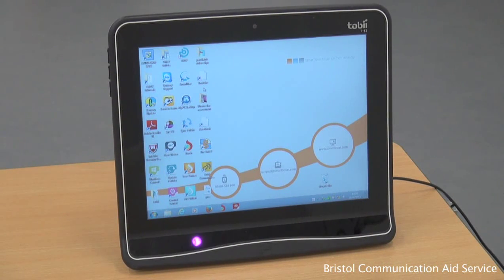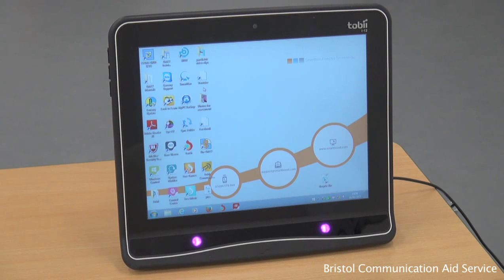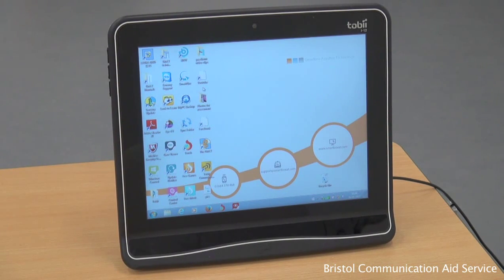Different brands of eye gaze device are available. However, for the purposes of this demonstration, we will be focusing on the Tobii Dynavox i12.